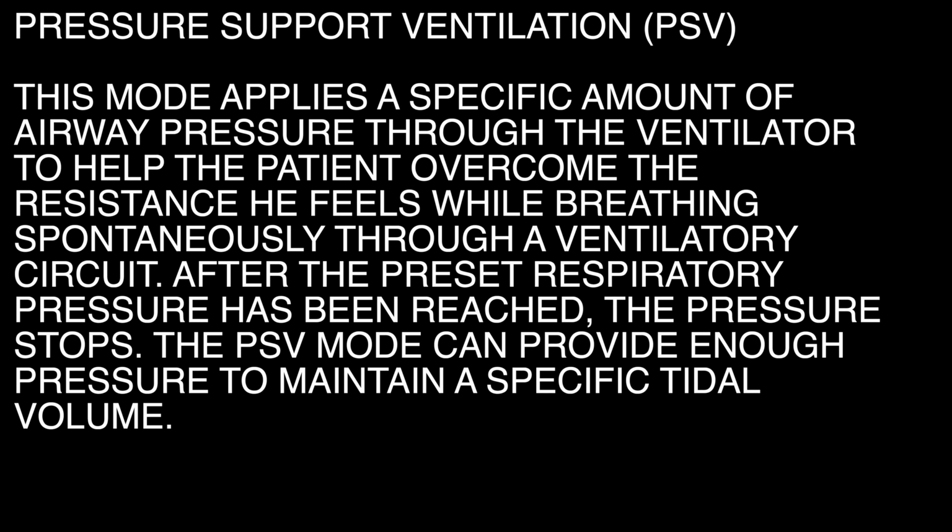Pressure support ventilation, PSV. This mode applies a specific amount of airway pressure through the ventilator to help the patient overcome the resistance he feels while breathing spontaneously through a ventilatory circuit. After the preset respiratory pressure has been reached, the pressure stops.